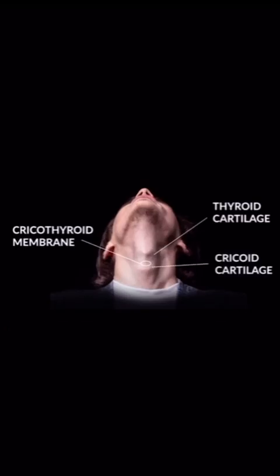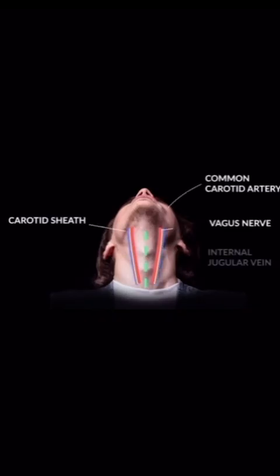It's important to notice that these key structures lie midline within your patient, which is why your patient needs to be in a supine position, especially in an emergency situation, as there are other important structures immediately lateral surrounding the area which you need to be mindful of, such as nerves and blood vessels.